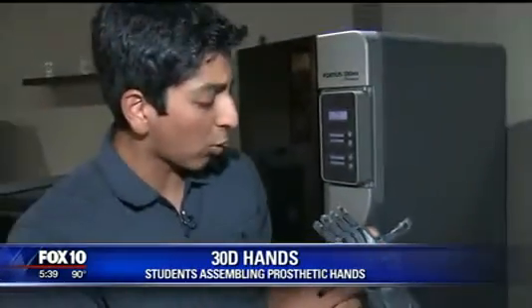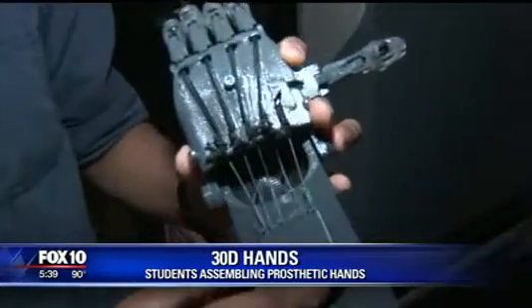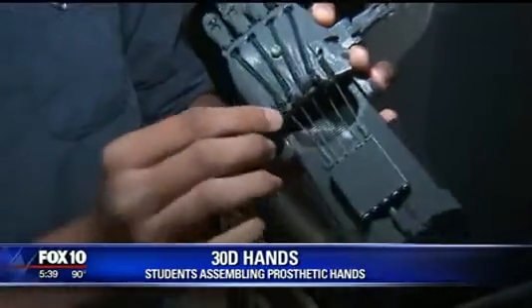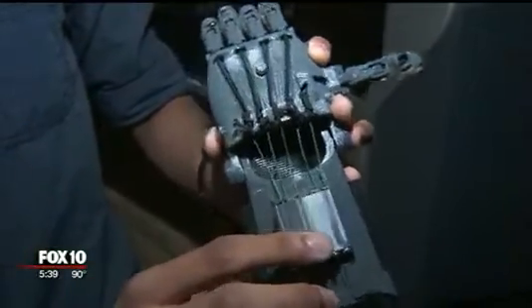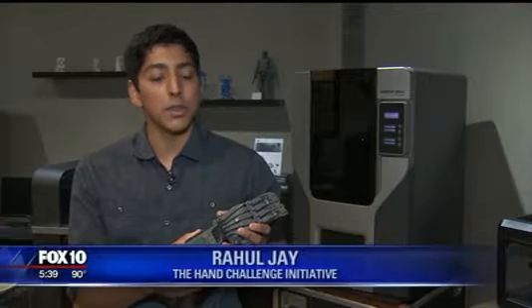There are all these elastic cords and fishing wires that are strung across the hand. The design is complex but the idea is simple. My dad — Intel actually hosted an event where this company provided the hands and Intel assembled them. My dad participated in that event, told me about it, and I thought it was pretty cool, so I wanted to do it at my school.